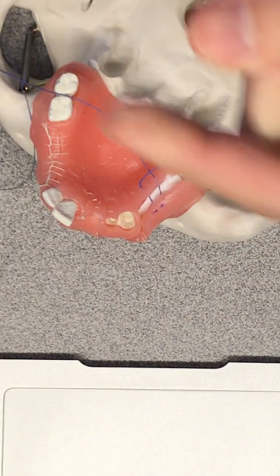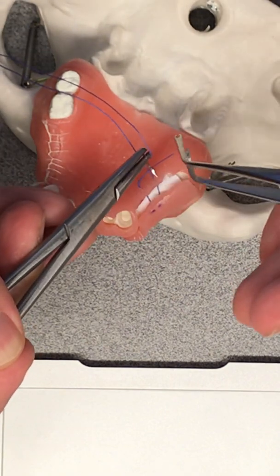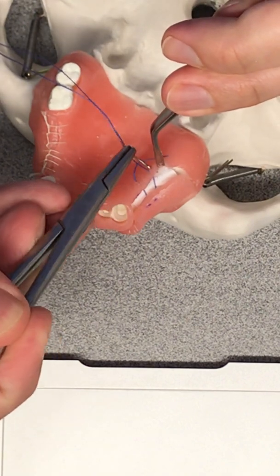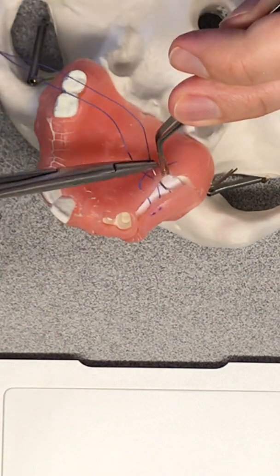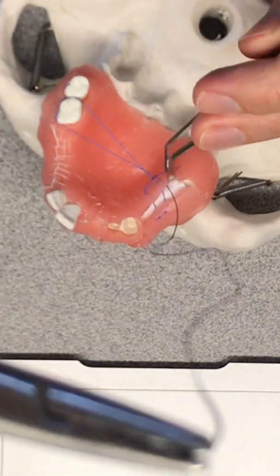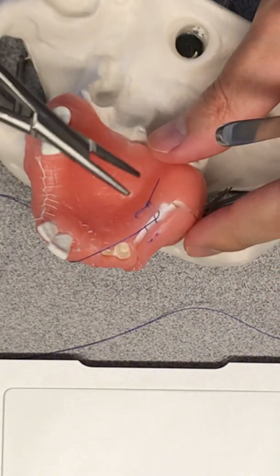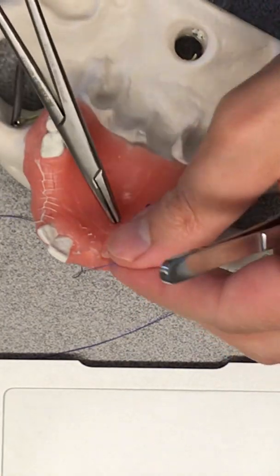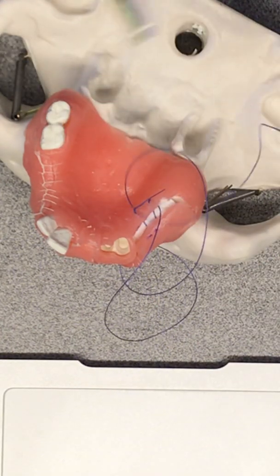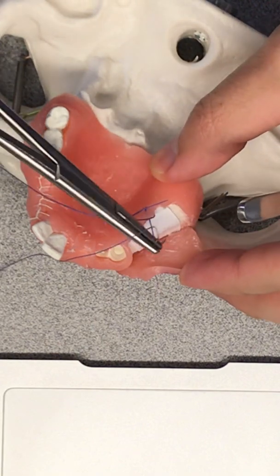Then into the palatal flap again, epithelium to connective tissue, without going through the membrane. We can then take another bite from the periosteum.